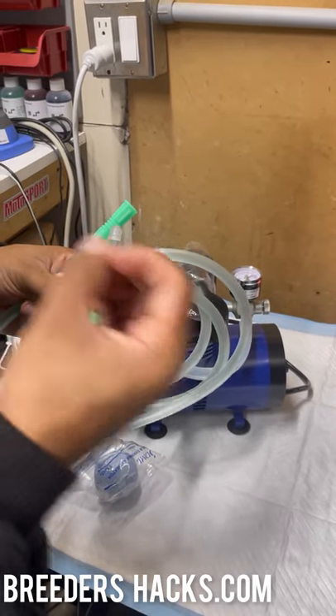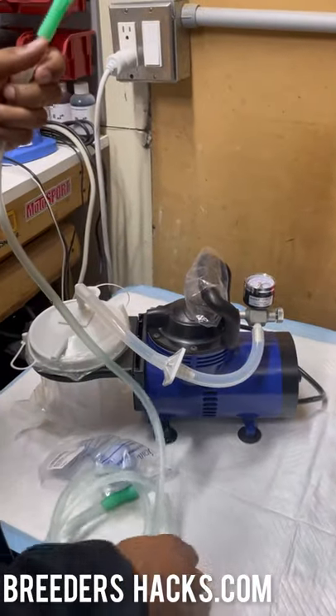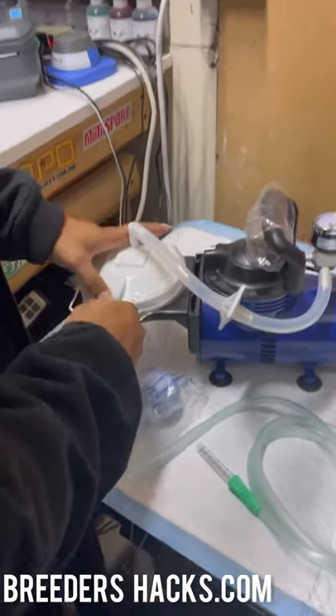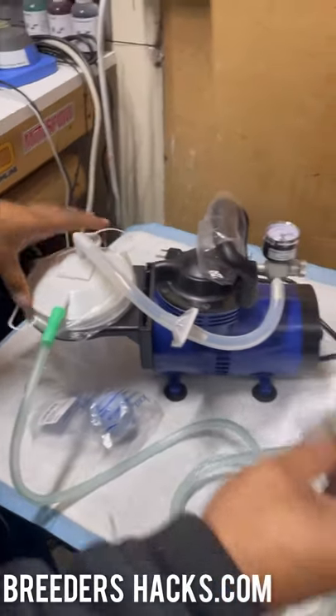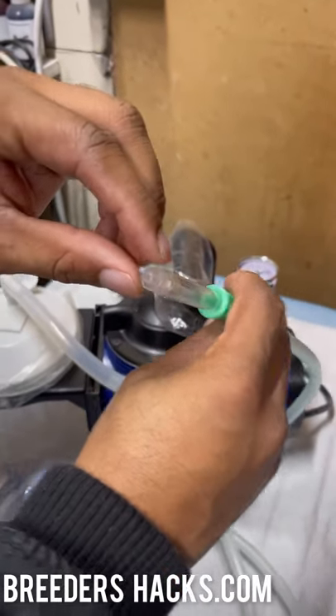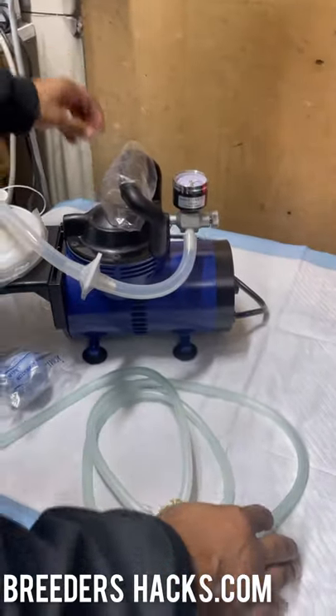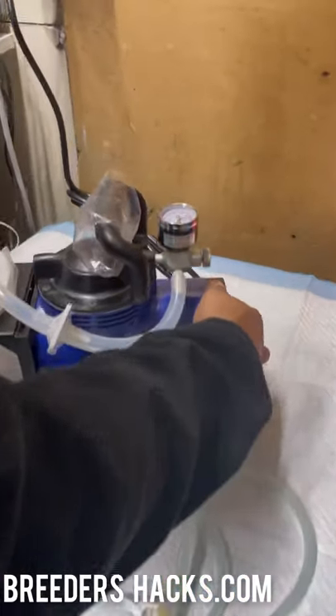Without this retrofitted piece, the opening is too big to get proper suction on a puppy's nose. Take the hose and connect it to the front of the canister like this. Now you're good to go — this is the perfect size to hold up to a newborn puppy's nose.